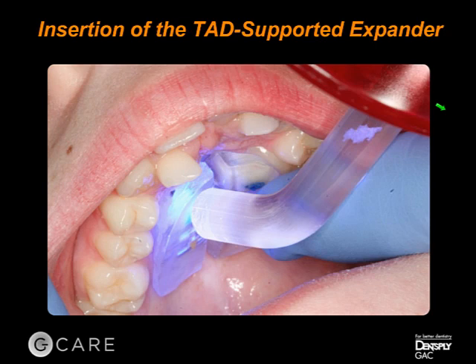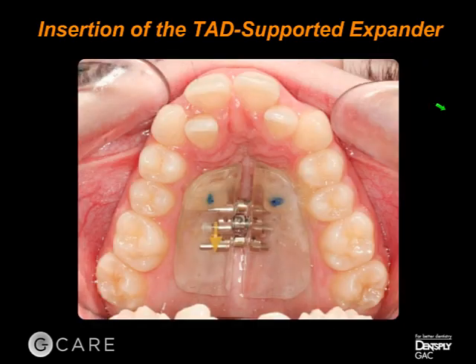This whole process, like I said, takes me about 5 minutes of chair time after the TADs are placed, and then here it is in the mouth. Okay, and now you can begin activating this immediately.